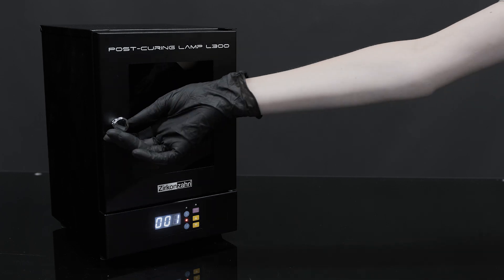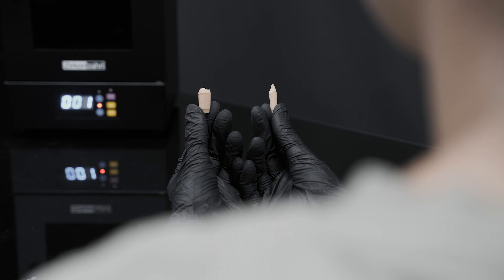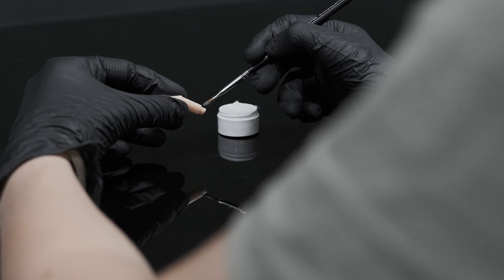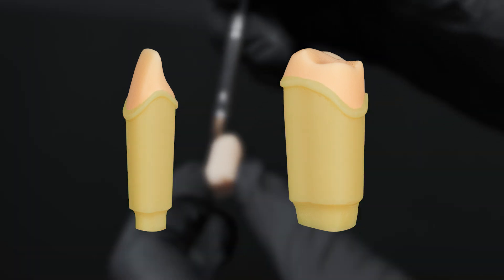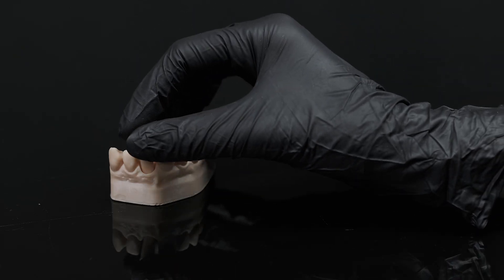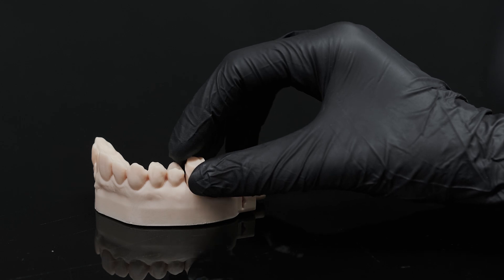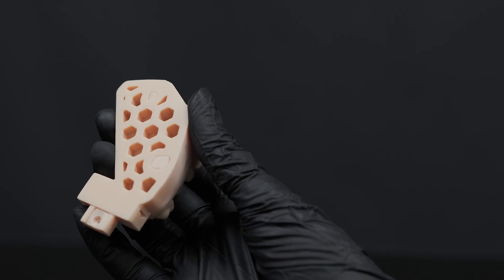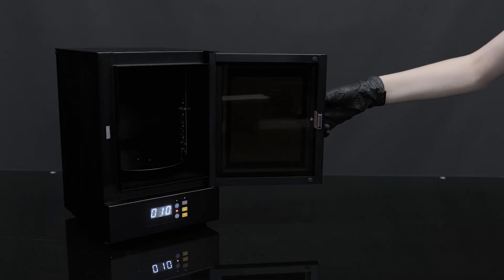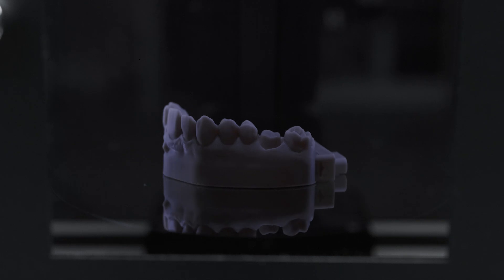Once the curing process is completed, take the dies out. Using a brush, apply a thin layer of Vaseline on the green displayed surface to ensure the die insertion and removal. At this point, insert the prepared dies into the models. Check the model base to make sure all dies have been placed correctly.